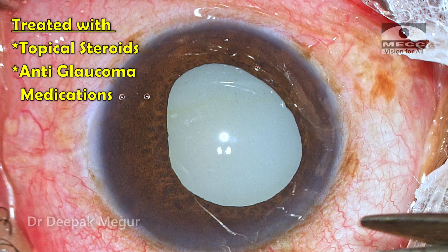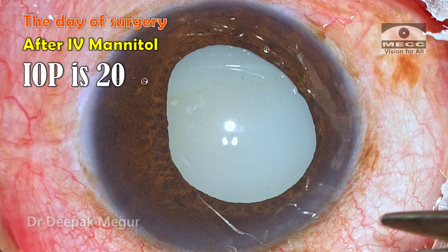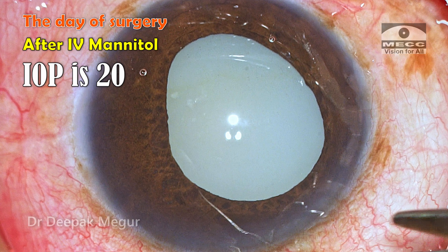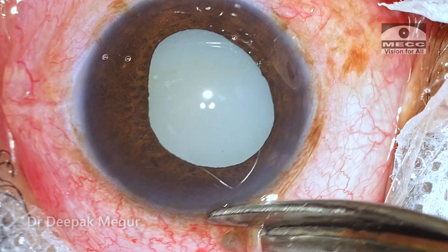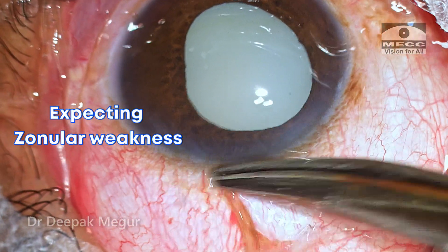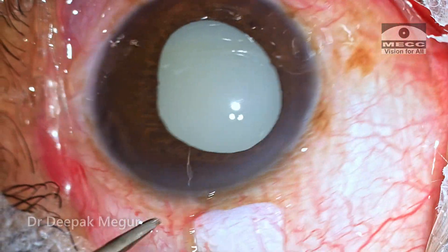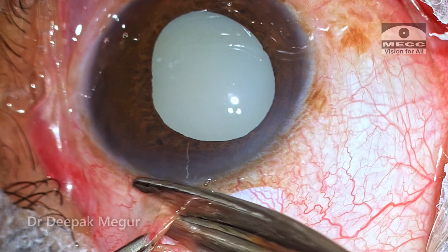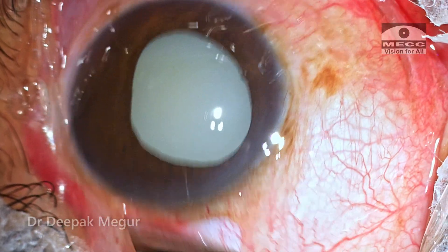She was treated with topical steroids and anti-glaucoma medications. On the day of surgery, after IV mannitol, the pressure was around 20, and I decided to do a manual small-incision cataract surgery. I was consciously expecting some amount of zonular weakness, and given this situation I thought it would be better to go with manual SICS and avoid phaco in this case.